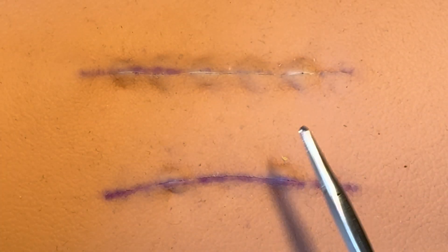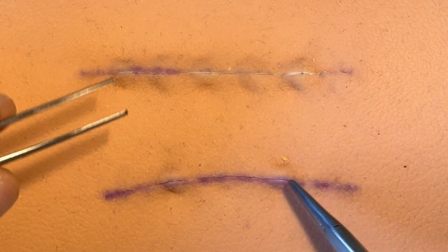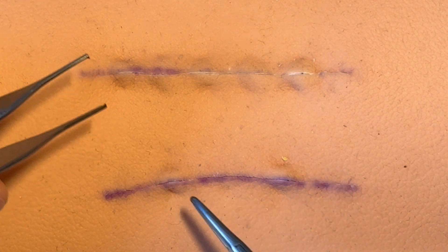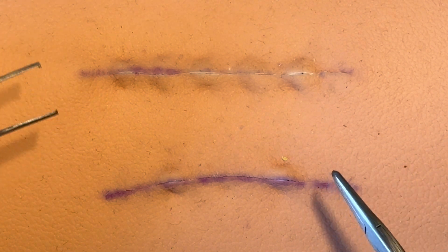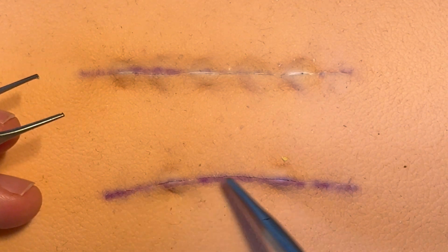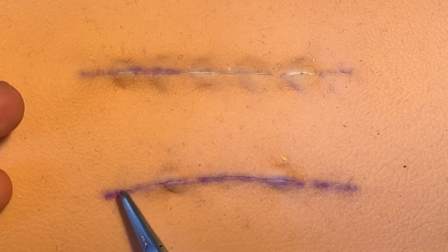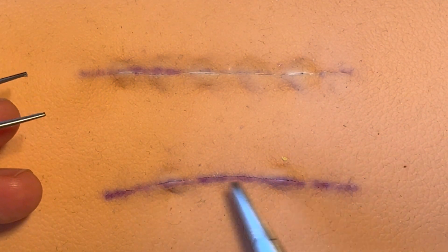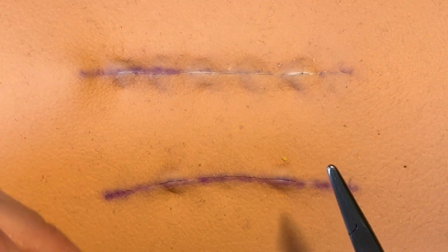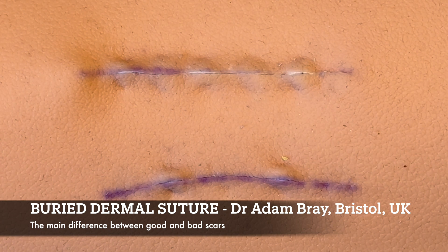You don't want the surface sutures to be doing any closure work — only fine alignment of height and tiny bits of apposition. There's no tension on the surface sutures, which means you won't get stitch marks or those problems. You can finish with a subcuticular running stitch underneath the surface, something on top, glue, or honestly since it's so well leveled with no tension, you could just tape it and it'll probably do really well. That is the most important technique to master — if you master that, you'll get great results most of the time.